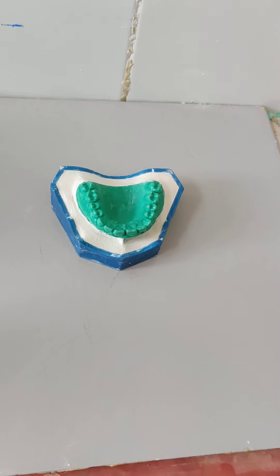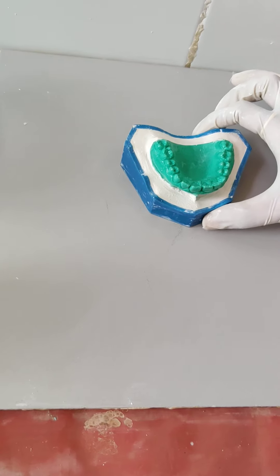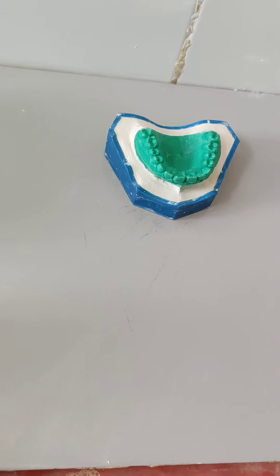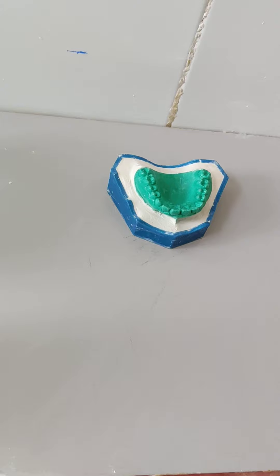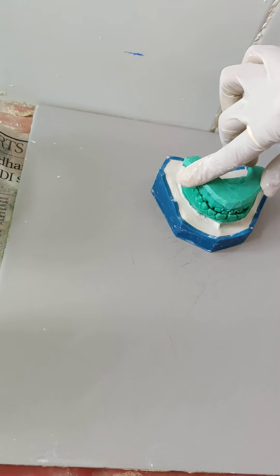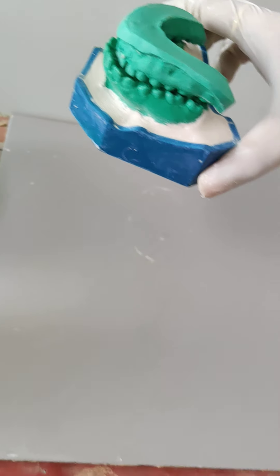This is the final maxillary cast with the base very nicely trimmed. Now with the maxillary cast we are going to occlude the mandibular cast in proper occlusion and then we are going to make the base for the mandibular cast.